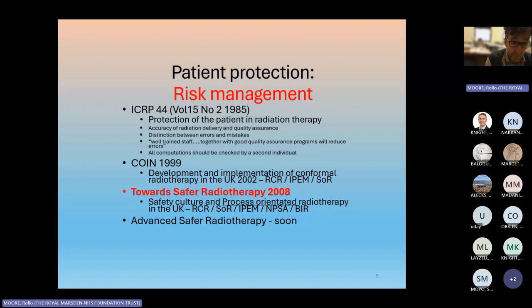And we moved through some implementation of a more modern approach to radiotherapy called conformal radiotherapy, which involved a degree of sophistication in the shaping of the radiotherapy beams to conform to the tumour and thereby spare the organs at risk which surround any tumour from excessive and problematical radiotherapy dose.